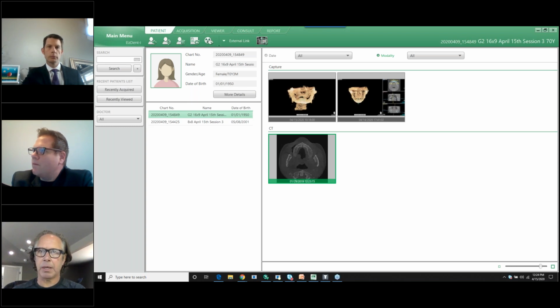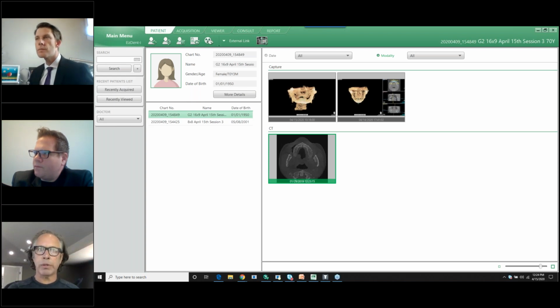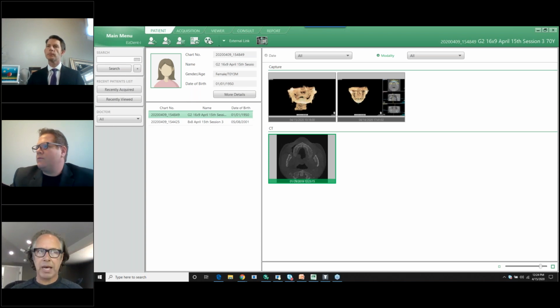The number one thing that should be on your mind is how astute is this individual or company at making guides? Are they coming back more resourceful after COVID and starting to figure out if they could do it? Is the quality control manager the one that is inputting all the information because they have to make sense of her job, or what is it?